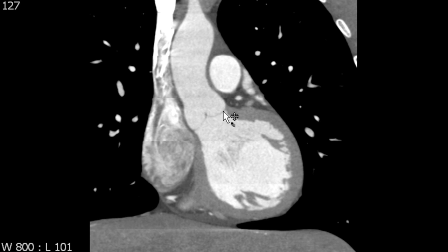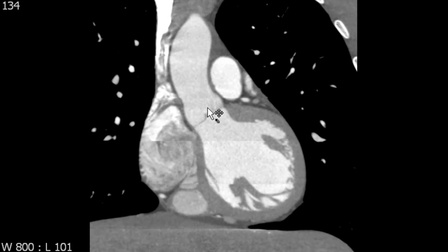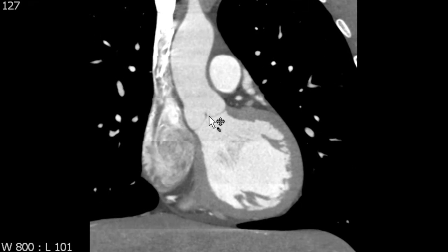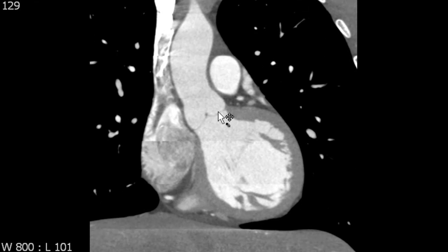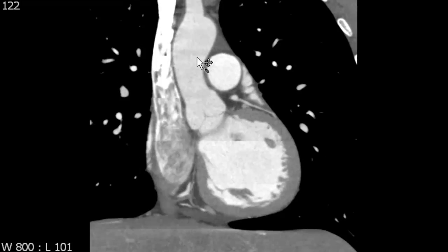So again we have the aortic annulus, the sinuses of Valsalva, and the sinotubular junction. When describing dimensions of the aortic root, the most complete description includes a diameter at the level of the aortic annulus, a diameter at the level of the sinuses of Valsalva, and a diameter at the sinotubular junction, in addition to your ascending aortic diameter and so forth.